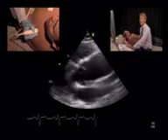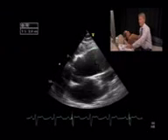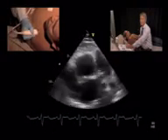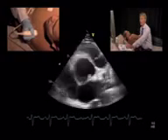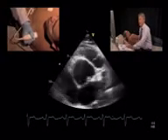And in addition, the ascending aorta is also dilated. So this, together with the morphology of the valve, is almost indicative of a bicuspid aortic valve. And we can exactly see the morphology of the valve here in the short axis view, and it's clear that the patient only has 2 cusps as opposed to 3. But we also note that the valve opens quite nicely, and we do not have the impression that the valve is stenotic.